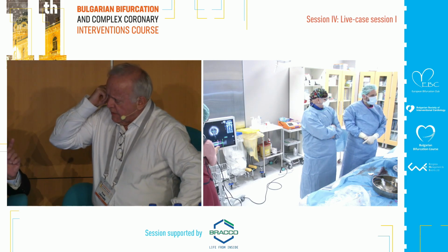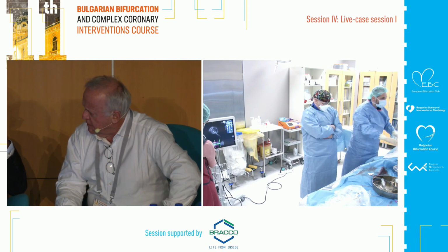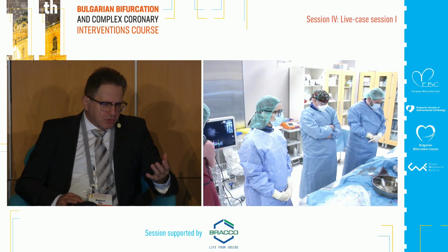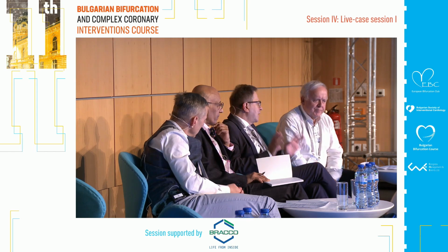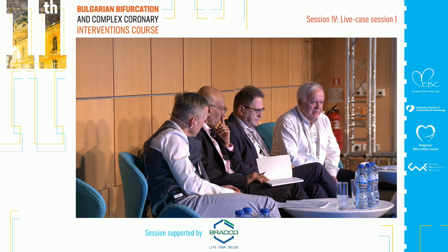Jean-Luc? There is also always a problem with the preparation of ostial lesions. Theoretically, this is soft plaque, and we shouldn't expect some slide of the stent, but anyway, I would predilate it, just to be sure, for this 8. If not, I would take 10. So Robert wants to predilate this lesion.